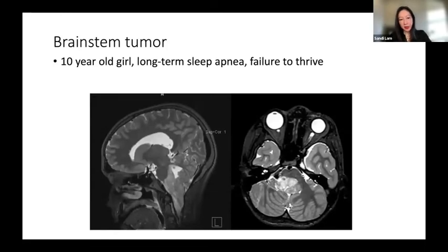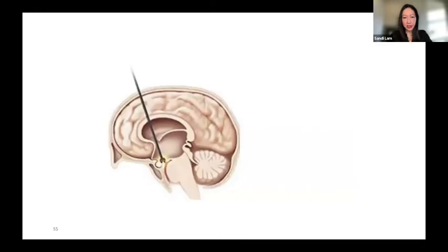So what about other applications? This brainstem tumor is certainly not something I would say let's take out with an endoscope, but I did intervene on the hydrocephalus here with an endoscope. Here, we can do an endoscopic third ventriculostomy, and then I thought about the aqueduct. We also needed to do a biopsy of that brainstem tumor because it looked atypical, so we were going to do this in different approaches and different steps.